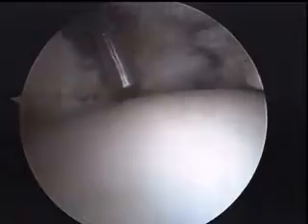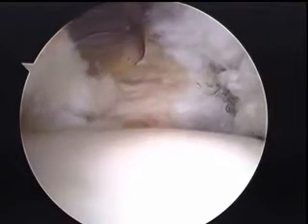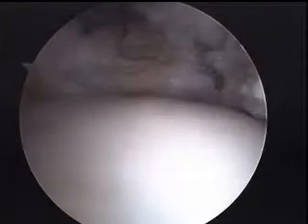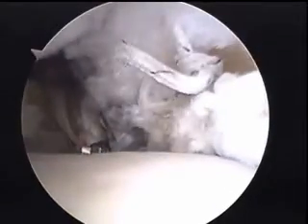And we've done a pretty good job here. We have pretty good visualization. So now we'll switch out to a high-speed burr, which will be performing the osteoplasty and resect the area of bone that's causing the impingement. Looks like a little piece of capsule still got up in there, so we'll get that out of there. Here's our burr. We're looking right at the line where it transforms from going curve into the flat surface, which is the impingement. So this is our alpha angle that we see on X-ray.